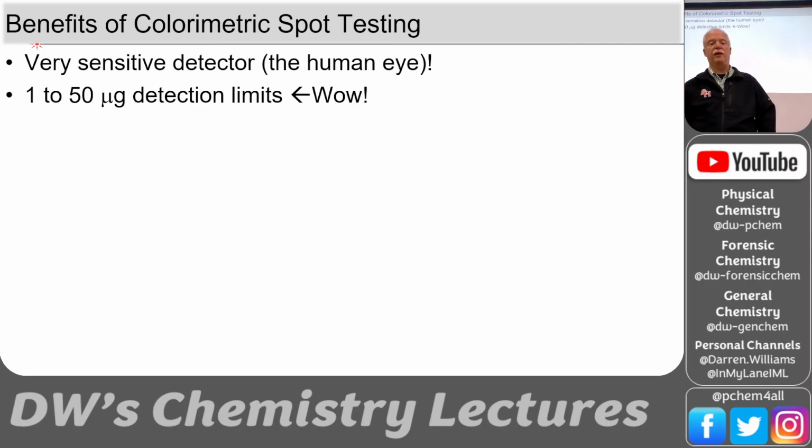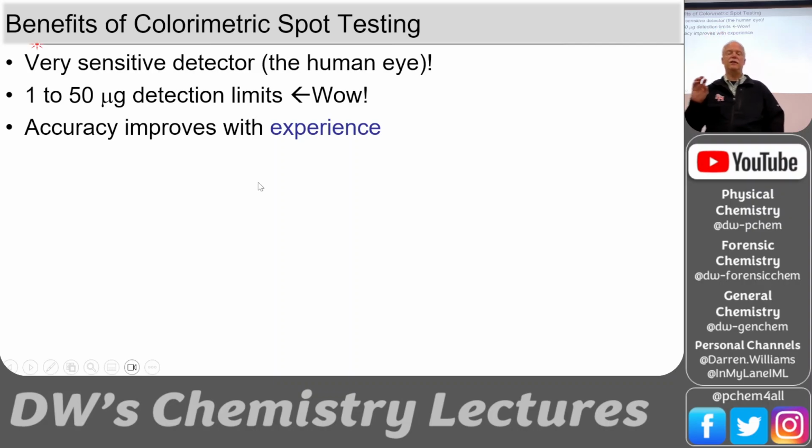So that's very good. Of course, this is a downfall for these kinds of tests because experience is needed. Like the first time you do it, you can follow the procedure and you think you're doing it right. The 100th, 1000th time you've done it, you've seen 1,000 of these and you know how long to wait. Sometimes you put the reagent on there and you have to wait 15 seconds or 30 seconds for the color to develop. And then you've got to read it within 1 minute, because then the color fades or changes. So there's a window at which you should read the test. Just like remember the COVID test, you had a certain window to read the color change. It said, wait so and so many seconds, but you can't wait too long, and so on. It's exactly the same thing.